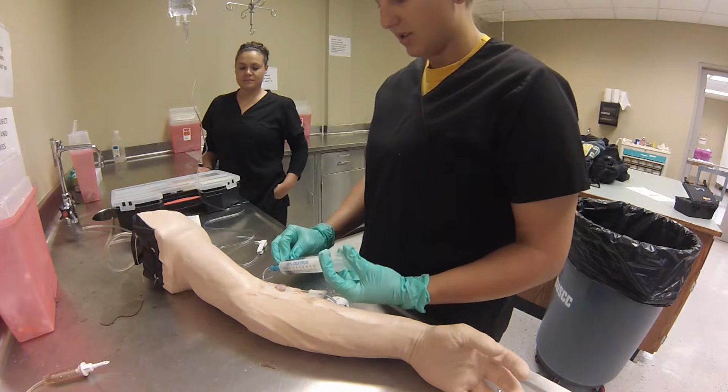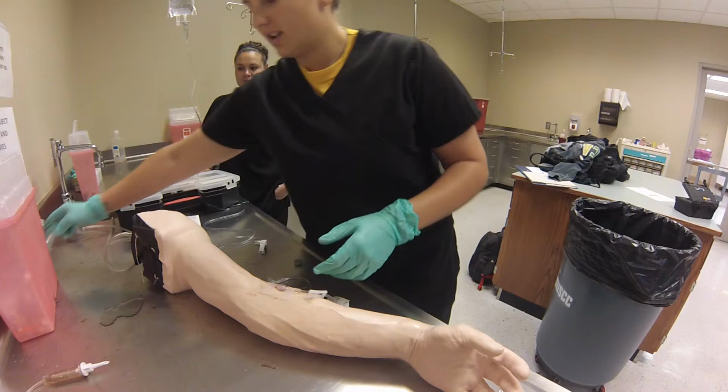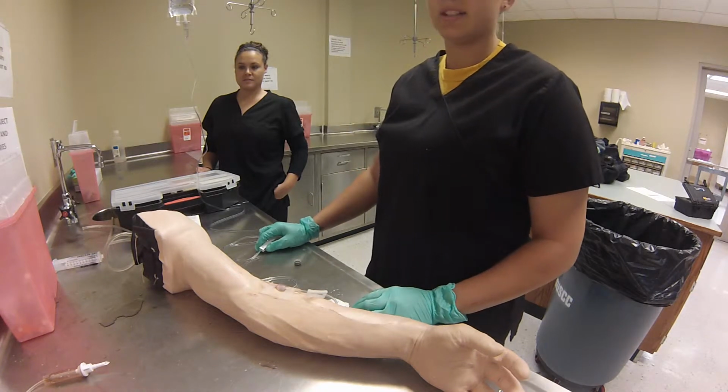All right, once I'm done pushing, I'm going to open the line back up and I'm going to place this in the sharps container. I'm going to go ahead and let my flow keep going, and I'm going to monitor my patient for any adverse effects.